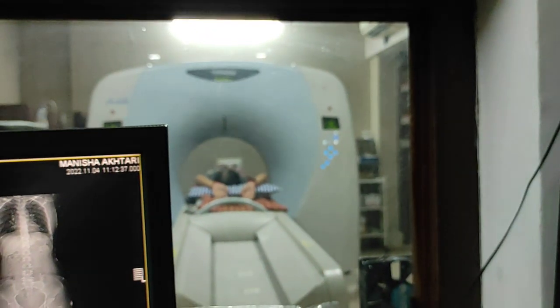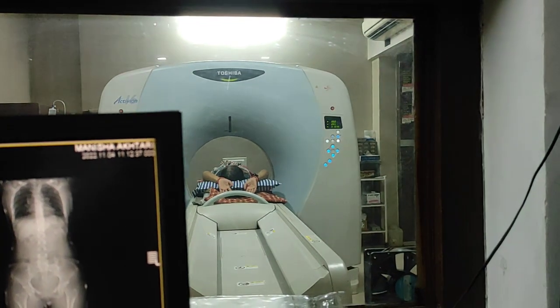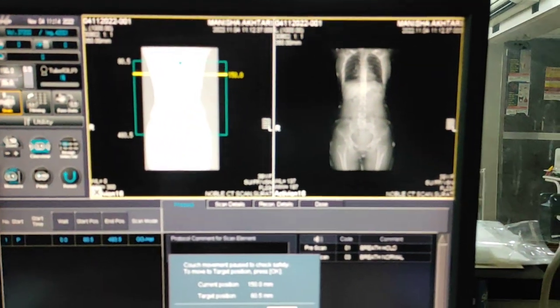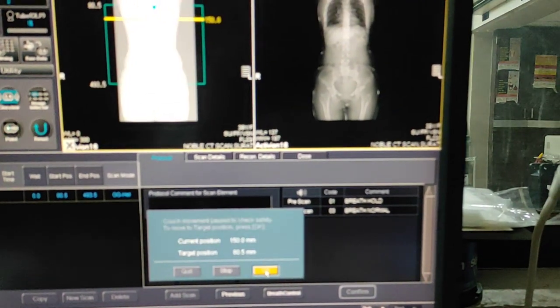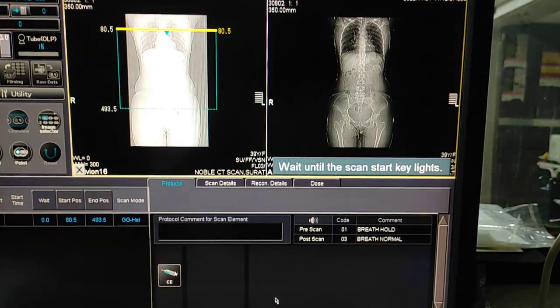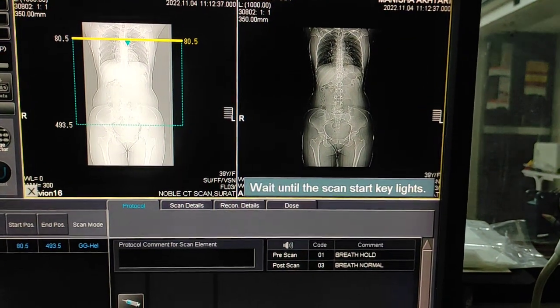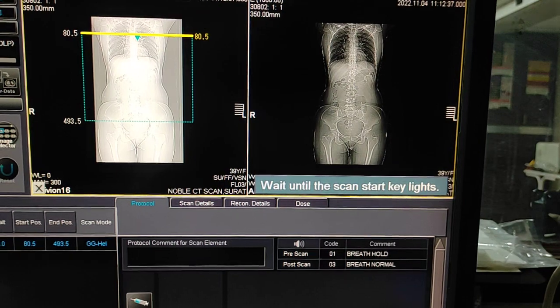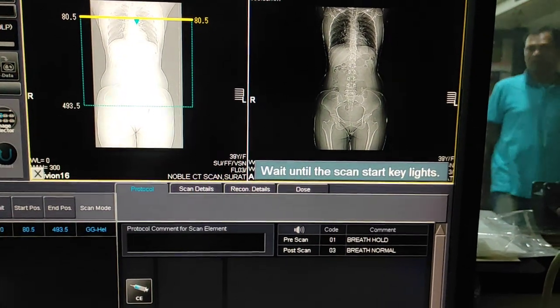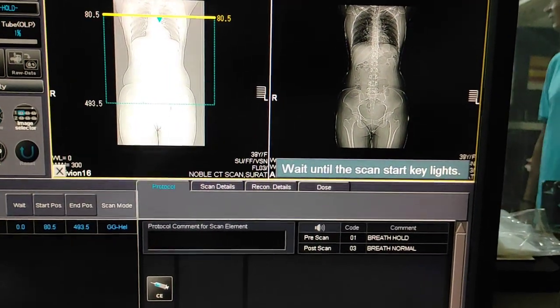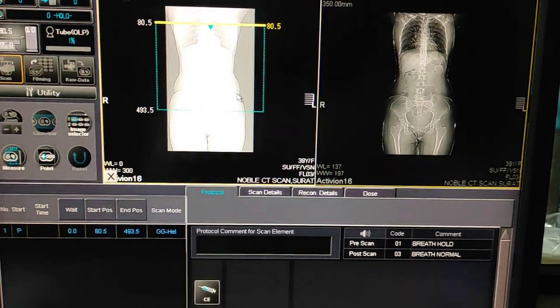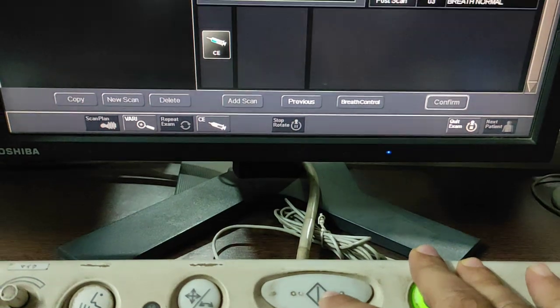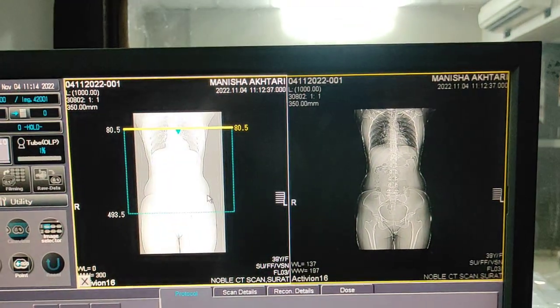Now we will move to the start position. Wait until the scan start key lights up and give proper instructions to the patient not to move. Once the scan key lights, click it. The scan will now go on.